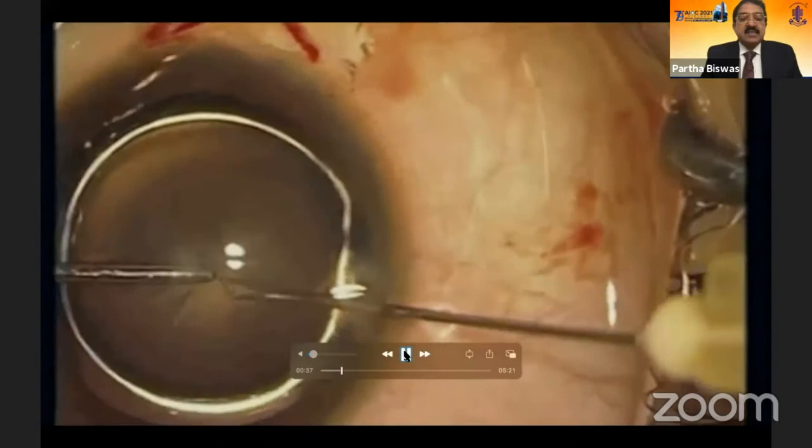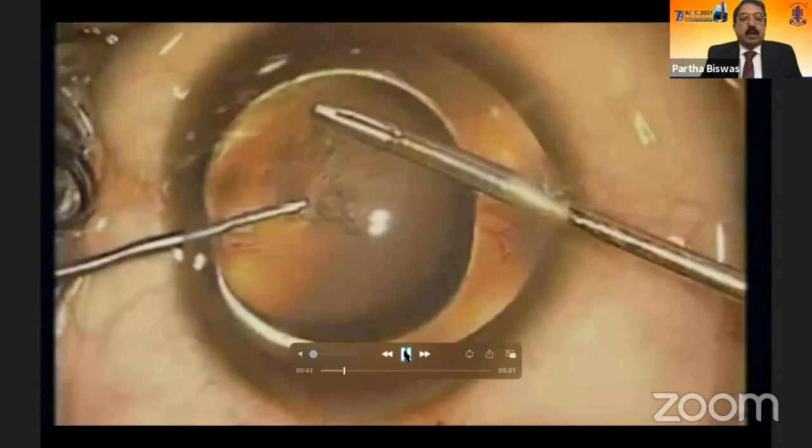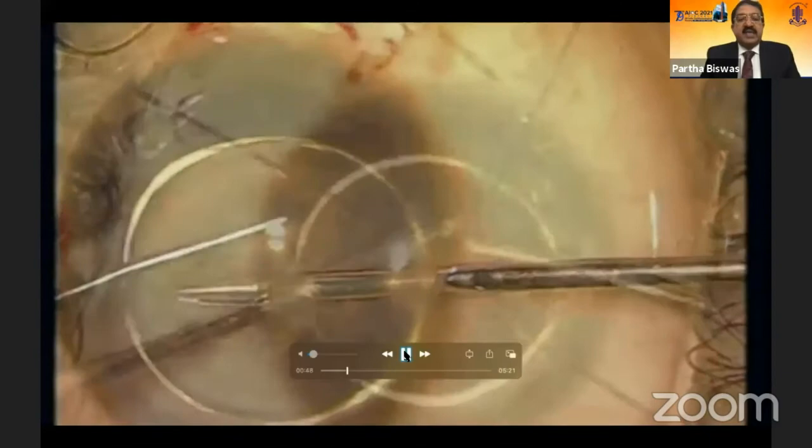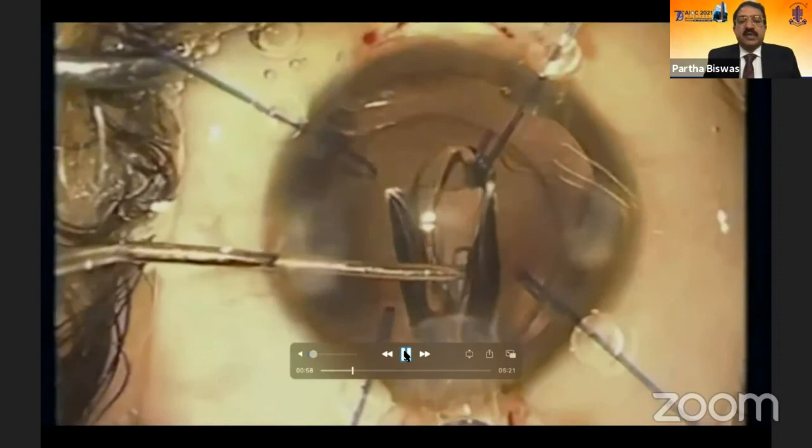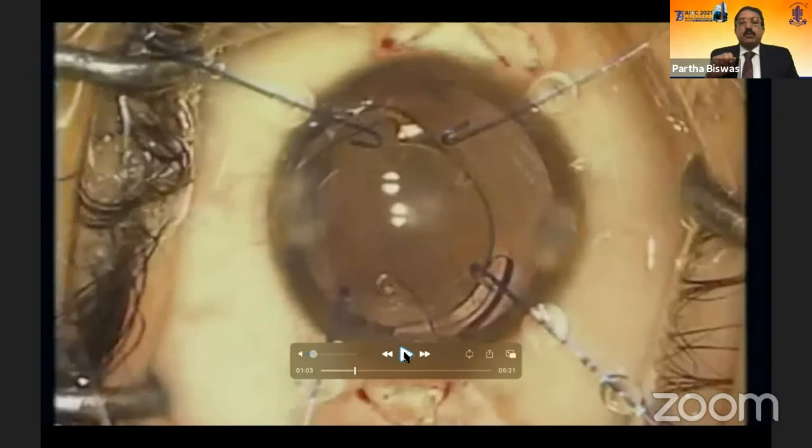And then a counter tension has to be given. This part of the whole technique is the time-taking part. It nearly took me 10 to 15 minutes to gradually complete it and come to an end. This part of the procedure is, of course, not so difficult, not quite simple. But here, one or two practical aspects: should we use a capsular hook or an iris hook? The iris hooks are smaller, and the microspherophakic bag is also a small bag. Therefore, the capsular hook, in all its integrity and finesse, is quite a large one and can destabilize the microspherophakic bag. So an iris hook, used gently, can hold that whole bag in place.